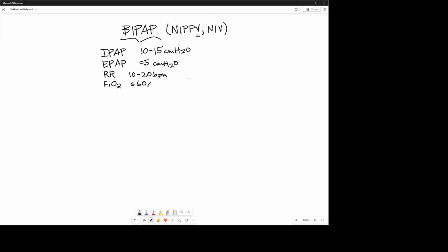And then you're left without any non-invasive forms to help them with. So you usually want to start generic and in the middle of the road, make it easy and comfortable. And if you need to make adjustments from there, you can. That's obviously something we want, to have room to go up. If you start in the middle of the road, you have some room to go up in the pressures to help them ventilate more if that's needed.